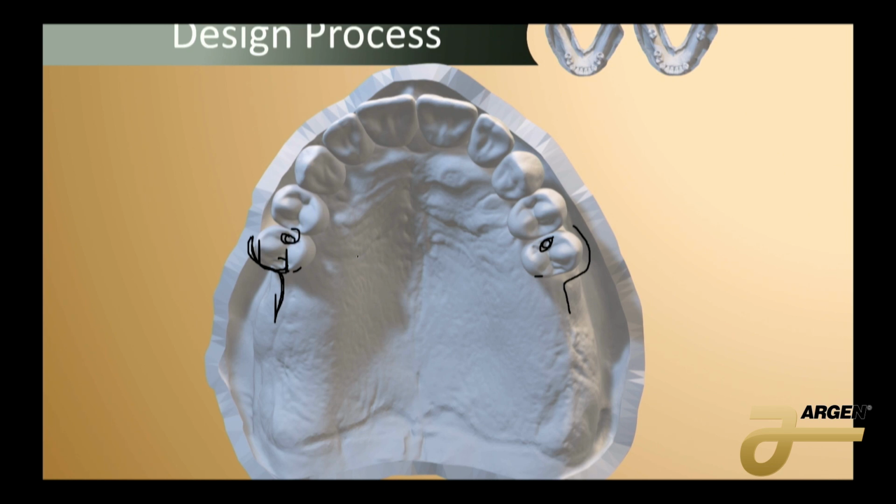So if we have enough space here, we can do an anterior-posterior palatal strap. So what we would do is draw it here in the back. This has to be 6 to 8 millimeters wide here. This is 6 to 8 millimeters here. Draw another one in the front. 6 to 8 millimeters here. 15 millimeters here. Now when we're drawing it in the actual software, we want it to be soft, curved lines, crossing the midline at 90 degrees, natural shapes, nothing harsh, nothing aggressive. We want this to be a nice, clean framework.